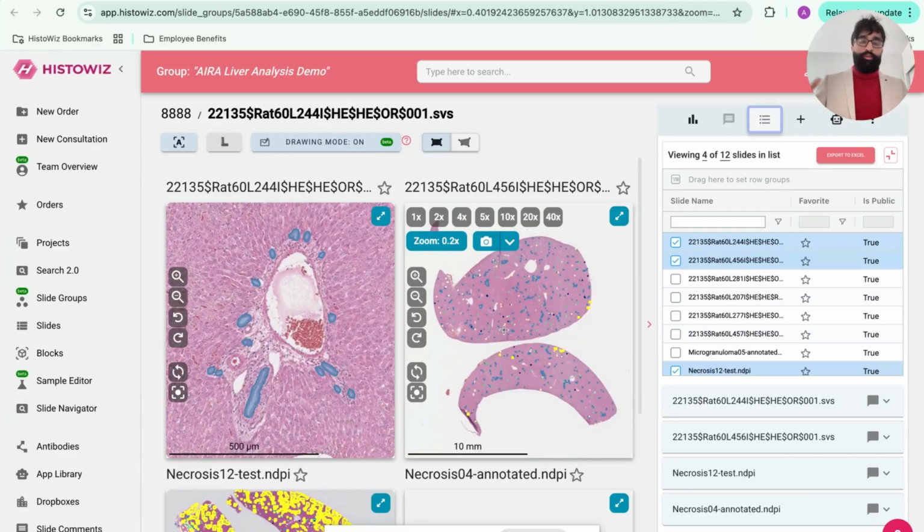And say you are running AIRA Matrix liver analysis on 100 slides, it will take some time once you click on run model, but you will be notified once the results are ready. And once it's ready, it's a matter of milliseconds for you to load those results and look for yourself.